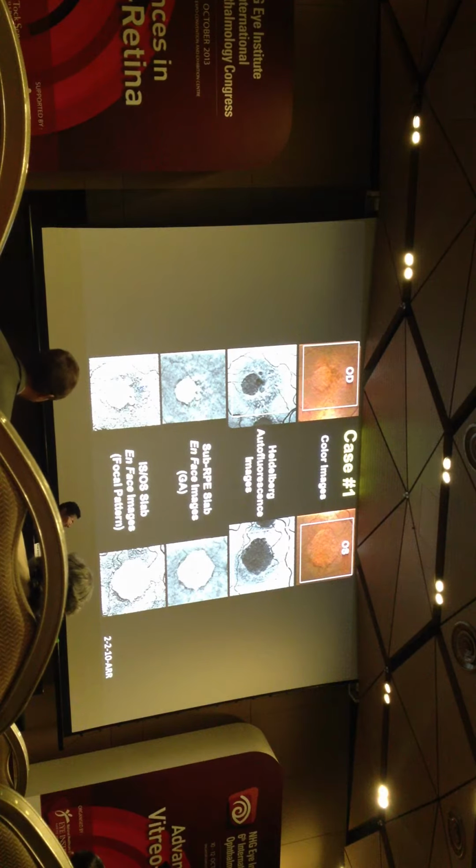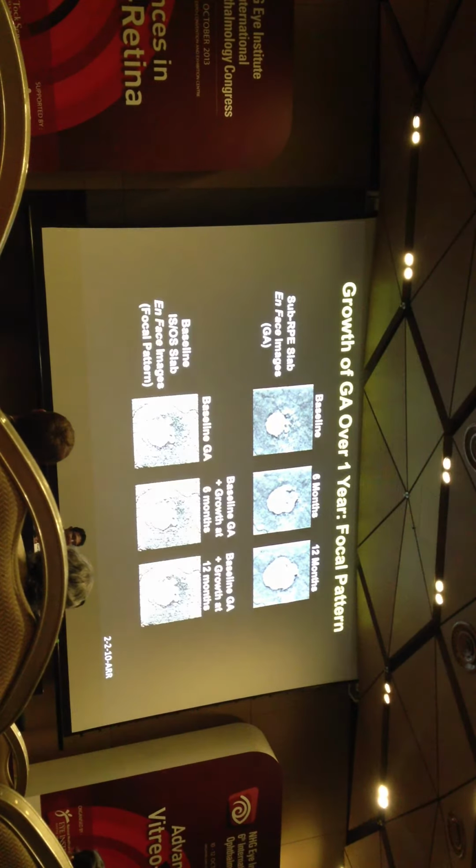See? Isn't that great? This argues that we really need to do pre and post bleach images, probably routinely. This is great. This is good. Okay? So photoreceptors are dead here. They're dead. We just haven't appreciated it because the geographic atrophy hasn't grown into that area.